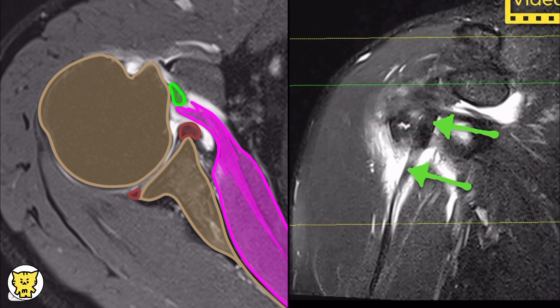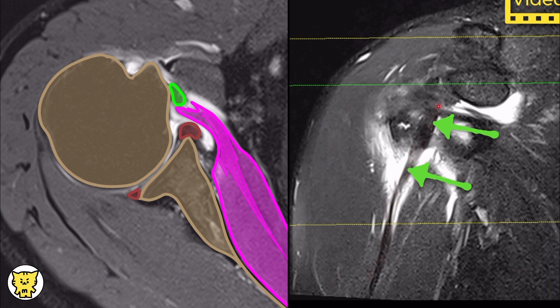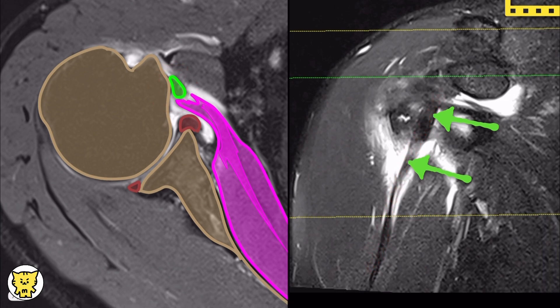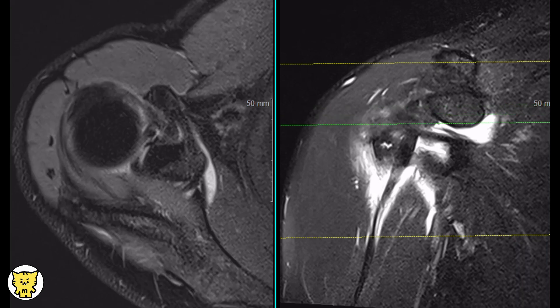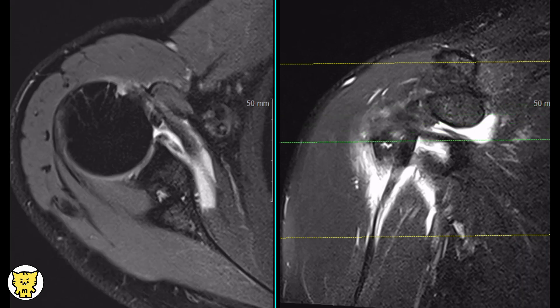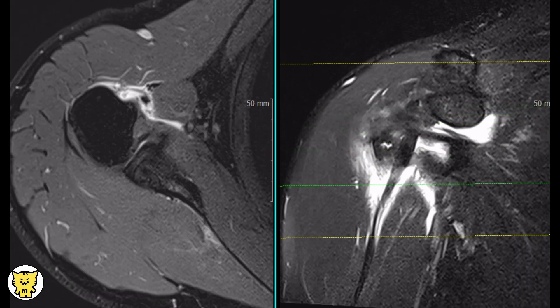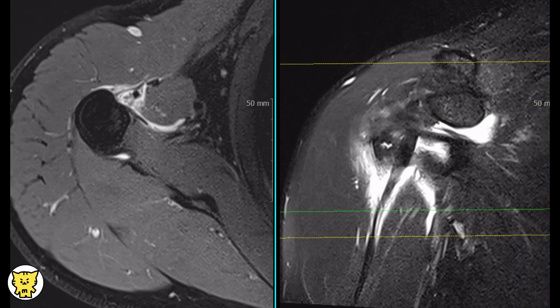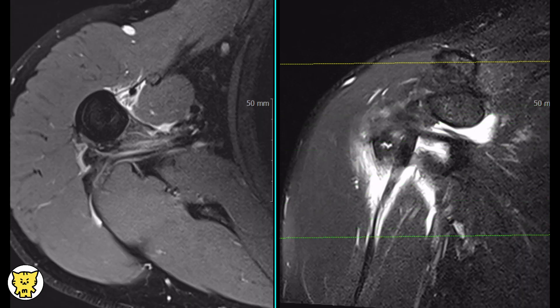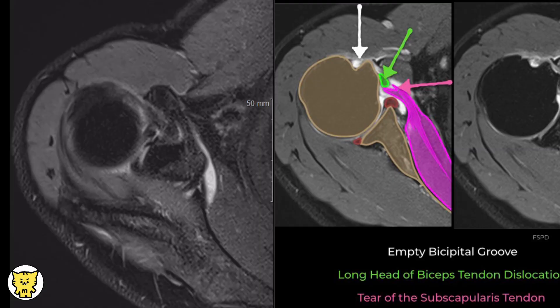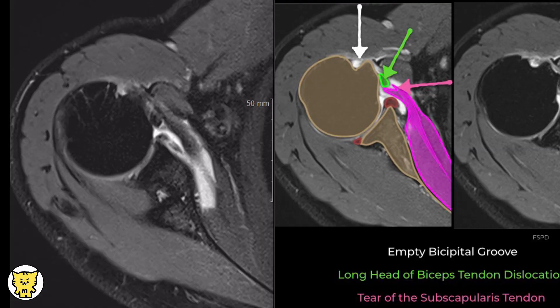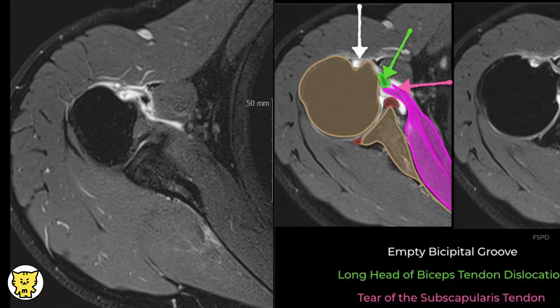This coronal image shows the medial dislocation of the long head of the biceps tendon highlighted by the green arrow. Most commonly, the superior subscapularis tendon demonstrates a full thickness tear, while the inferior subscapularis tendon fibers remain attached to the lesser tuberosity and the surgical neck.